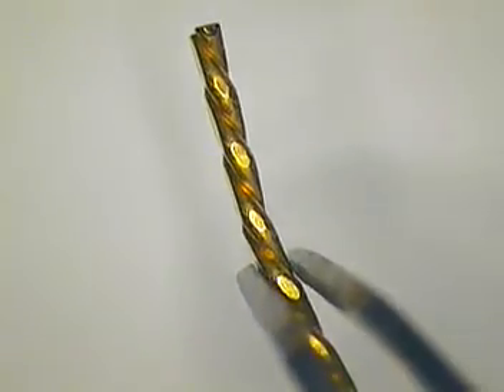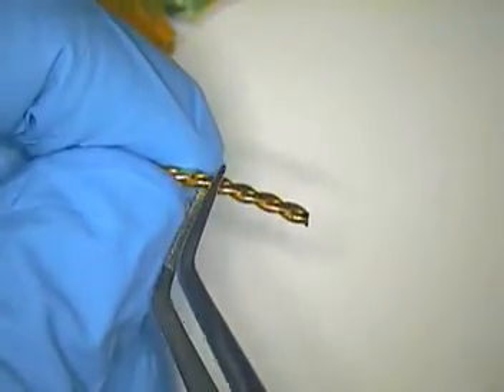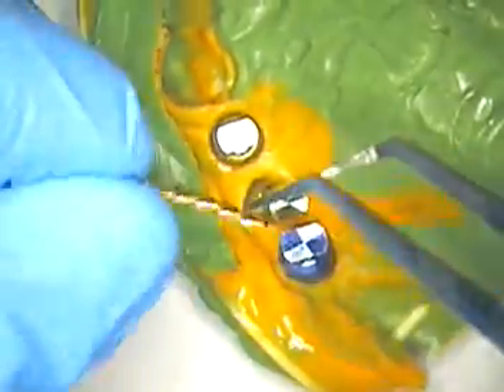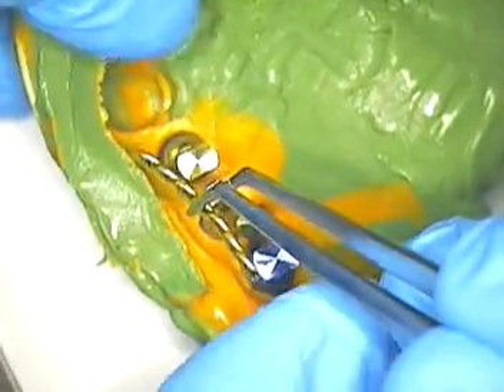Now we're ready to design the bar on this side, which has the analogs in place. Think about in the mouth — as I showed in my other video — this braided twist wire is very strong. It's precast wire, braided, meshed together, and then pounded to keep it rigid. In my mind it's extremely rigid — you bend it, it's not going to have memory. You want to bend it so it makes contact with all the analogs, just like bending a Holley retainer that makes contact with all the anterior teeth.